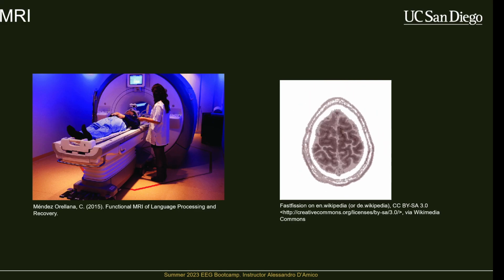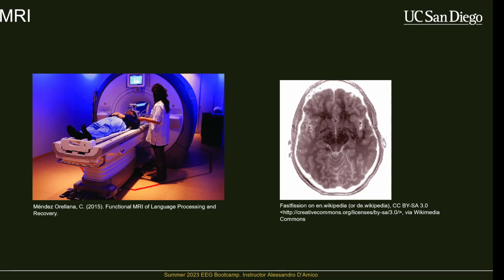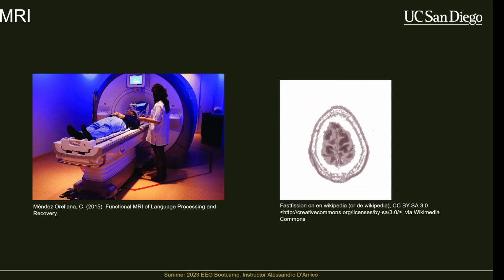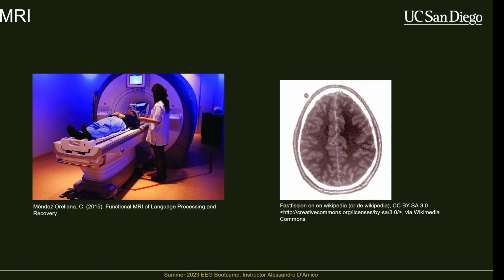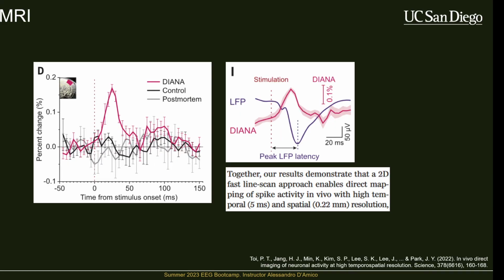It's very expensive. You have to spend like $1,000 an hour renting out the room sometimes to collect data. So this isn't something that you can have in your bedroom or something. Whereas EEG, for example, I have 13 of them in a closet. So it has its place, and even if this faster temporal resolution fMRI pans out, it'll get better temporal resolution, but it won't necessarily replace EEG.